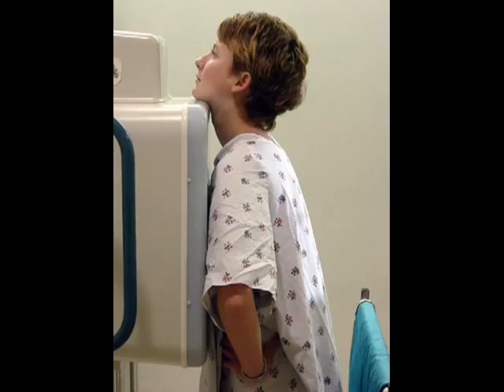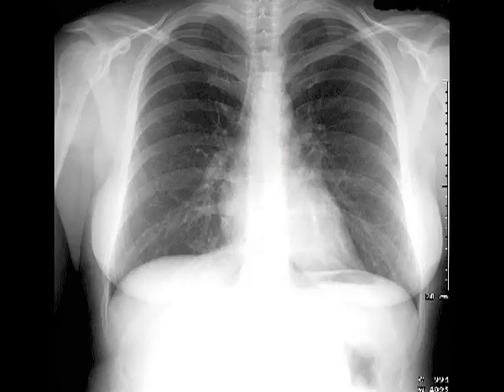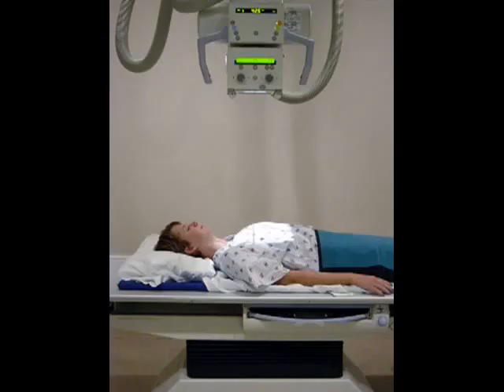With the basic concepts out of the way, let's talk about a couple of common presentations or positions for the chest x-ray. When the plate is at the patient's chest, this is called a PA chest, or posterior to anterior — because the x-rays travel from the cathode ray tube through the back to the plate at the front, passing from the patient's posterior to their anterior. Here's what that x-ray looks like — we'll go over different elements later.